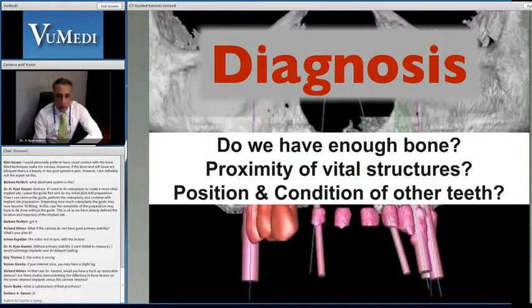So during the diagnostic phase, we have questions. Questions like, do we have enough bone? Where are the vital structures? And what is the position and the condition of the adjacent teeth?